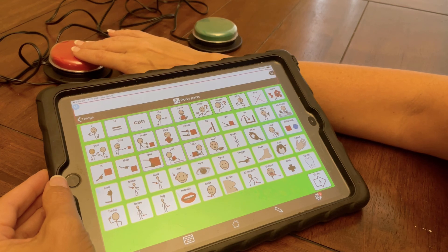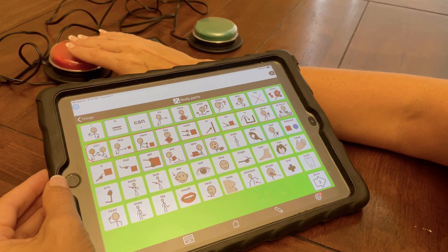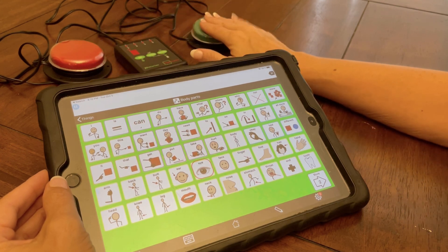Message. Grid. Body parts. One. Two. Three. Four. Arm. Back. Butt. Ear. Eye.